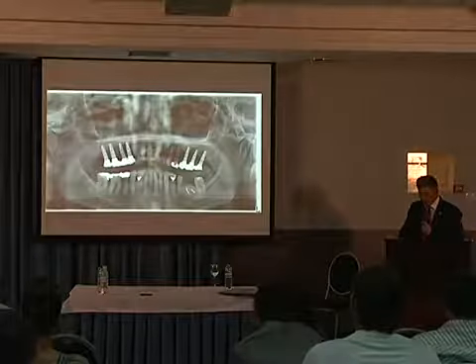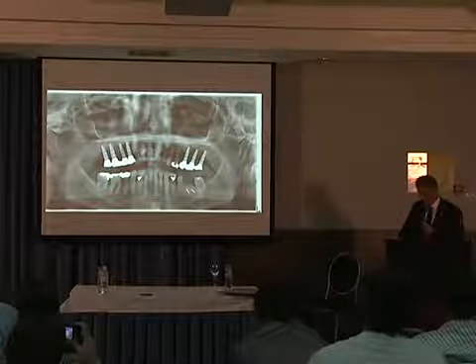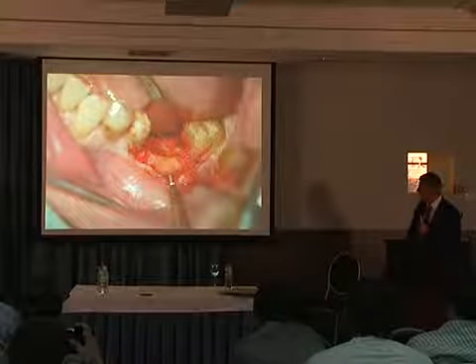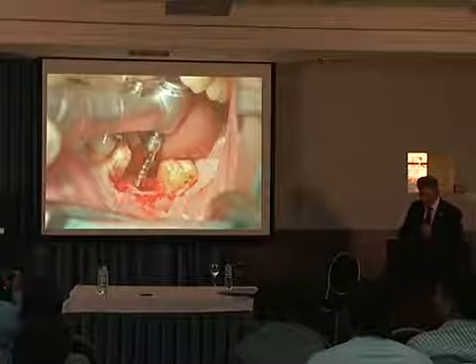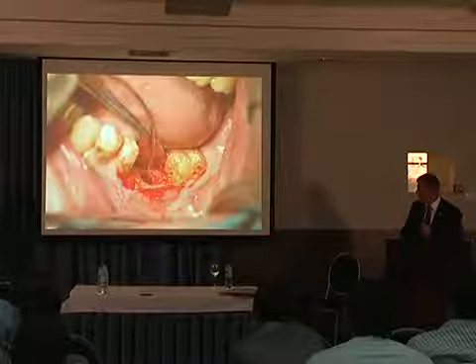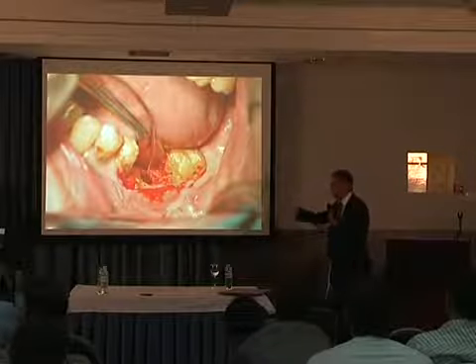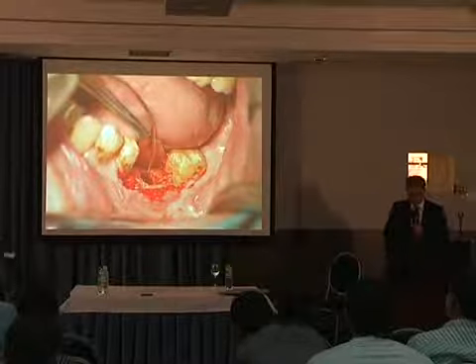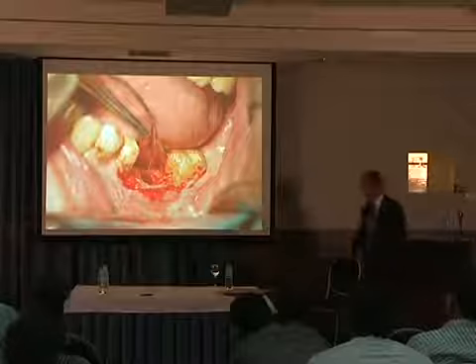The stitches are placed. Waiting 3 months. Re-entry. We opened, took out the screws. The diameter is now no more question. We measured the size of the alveolar ridge and chose the implant diameter. We can place, like implantology 20 years ago, wide body, wide neck, whatever. In this case we can place any implant system with a large body and large neck.